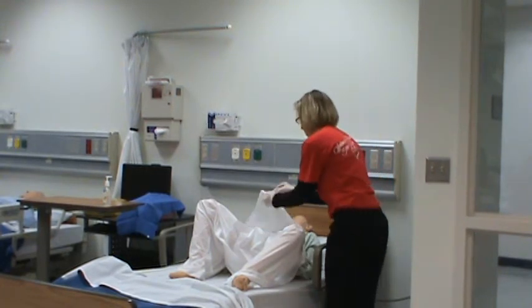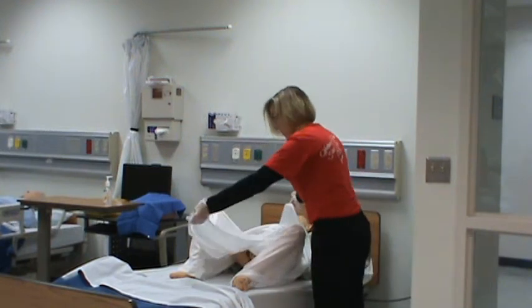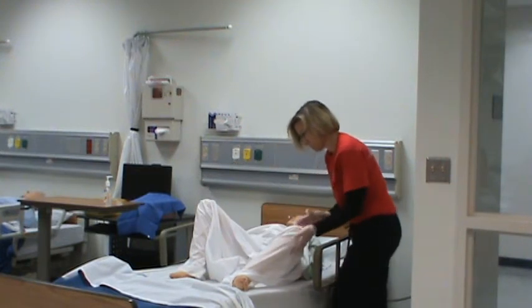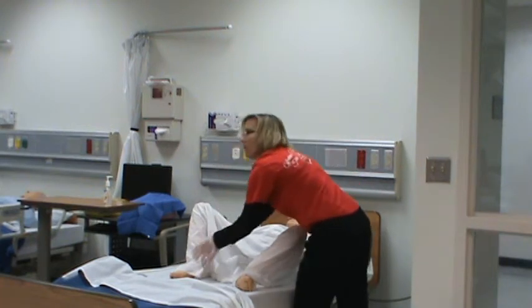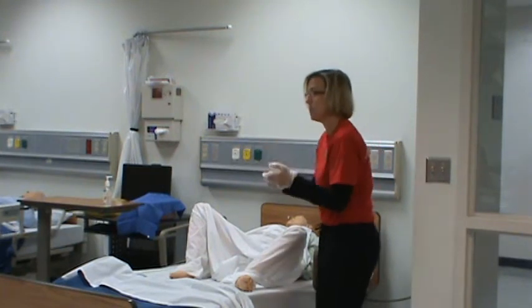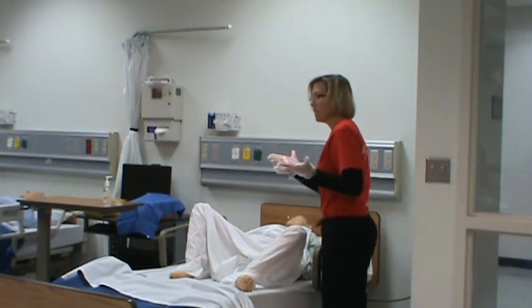So you take the corner of the drape, the sheet, and then you end up having the opposite, the diagonal corner of the sheet over here. So then I've got all this excess sheet up in here to wrap around, and then I end up putting the corners down here on their heels. So then I keep him covered until the last possible minute, because I'm going to set up, and that's what I'm going to demo in a minute, set everything up, and then you're going to be sterile.